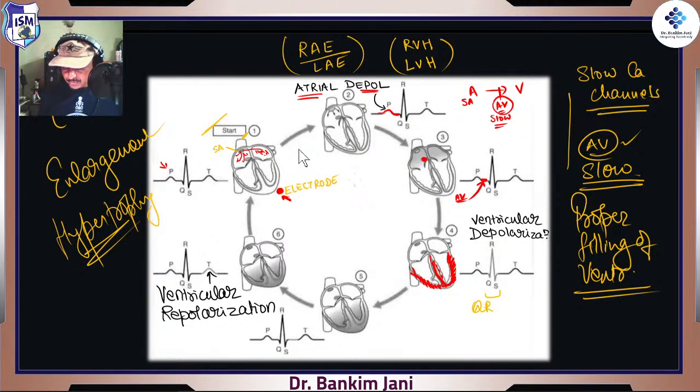So over here, this is what is called QRS. This QRS complex represents ventricular depolarization, because it is at this point that the ventricles are coming into action.